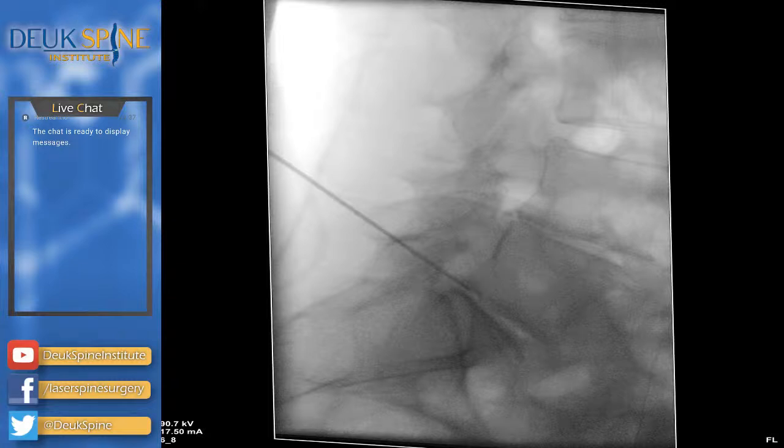We don't have a pseudo disc, I don't think, right? Let's see.